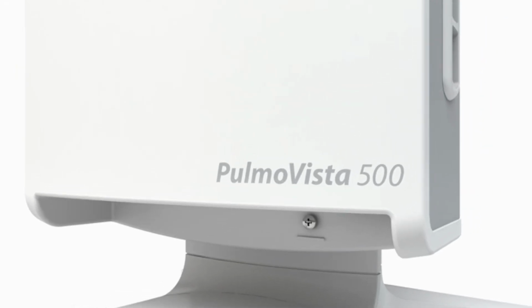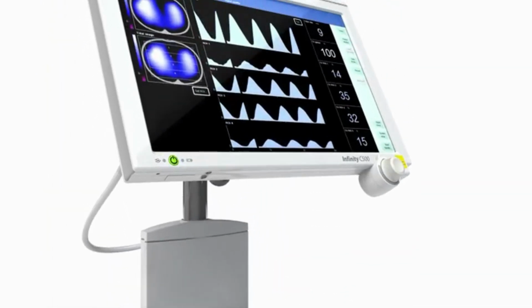Imagine visualizing, in real time, how air is distributed throughout your patient's lungs, right at the patient's side in the operating theatre. This is where Dräger's PulmoVista 500, an electrical impedance tomography solution, comes into play.